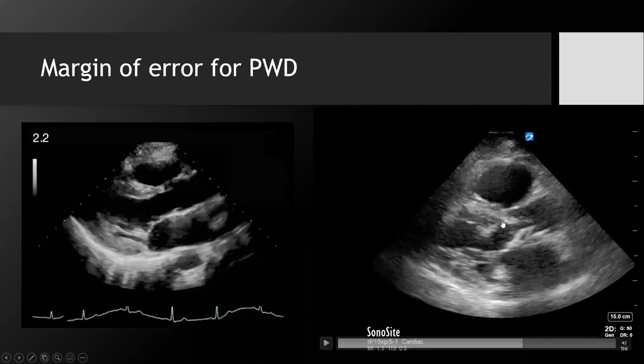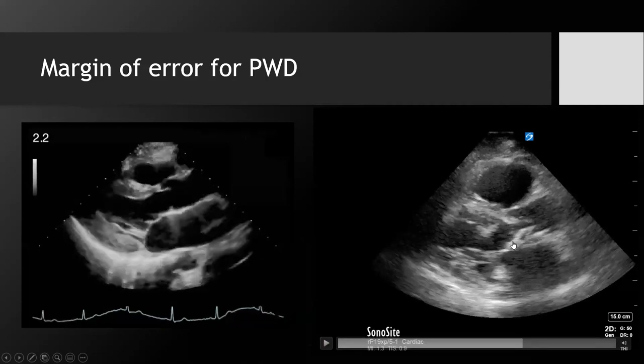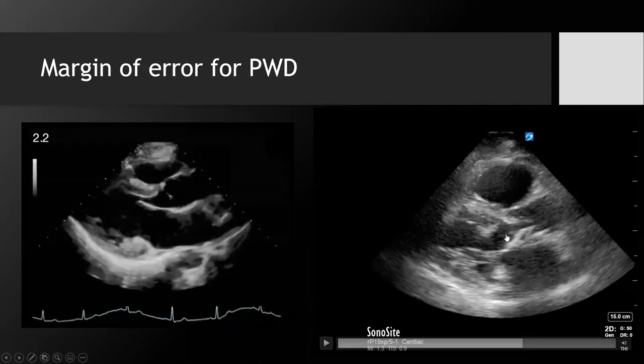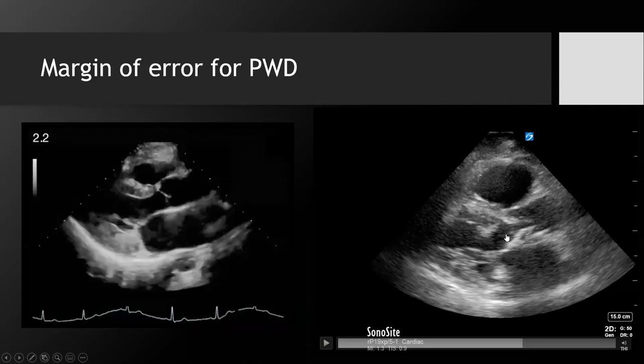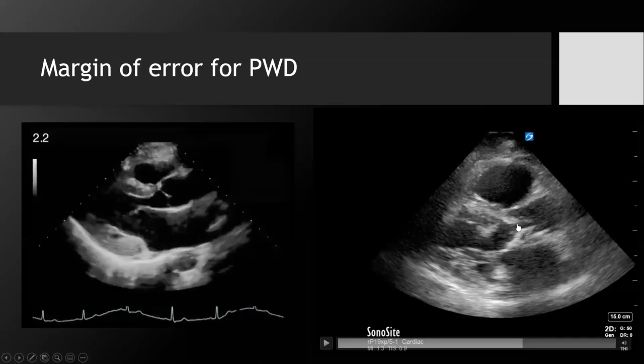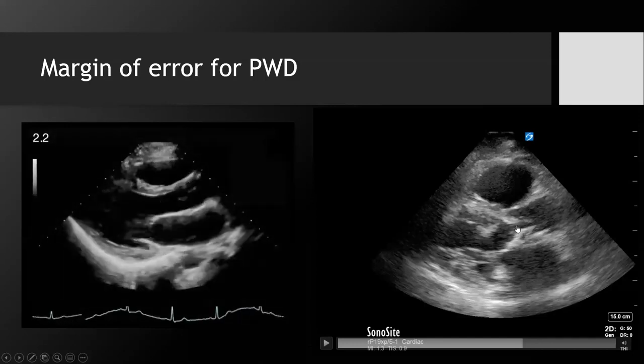It would still be the leaflet tip insertions. So it would actually be here, right? But it's going to be really, really tough, because you have to get your pulse wave channel there too. In theory, if you could identify this distance right here and see it both in your parasternal long and your apical 5, you can go off book and say you did it there. It should work. The math should work. It's just not the convention. So it would be very, very difficult to get an accurate cardiac output on this patient.